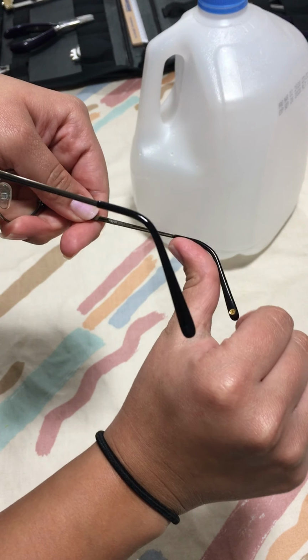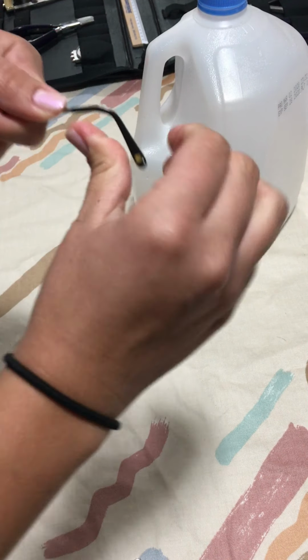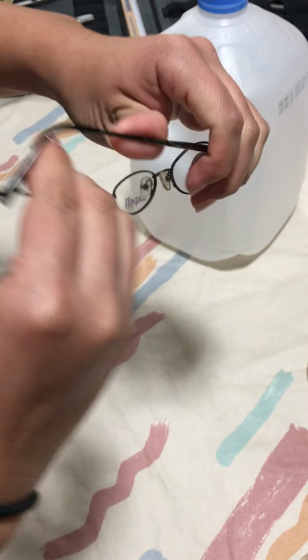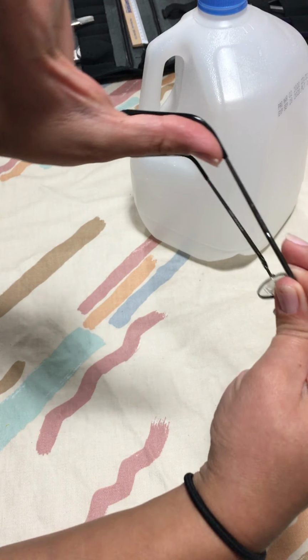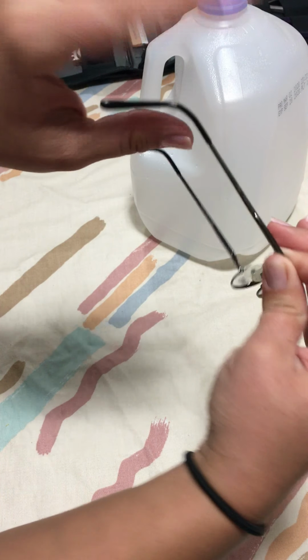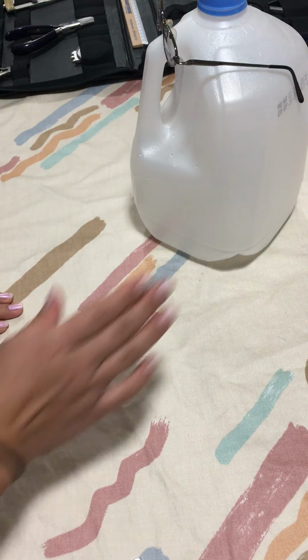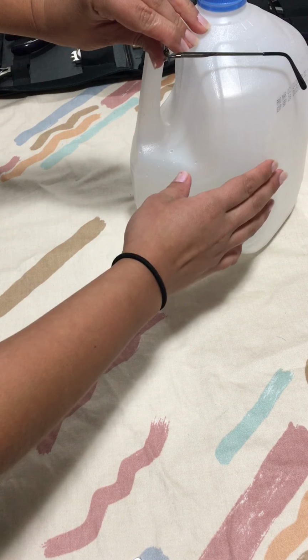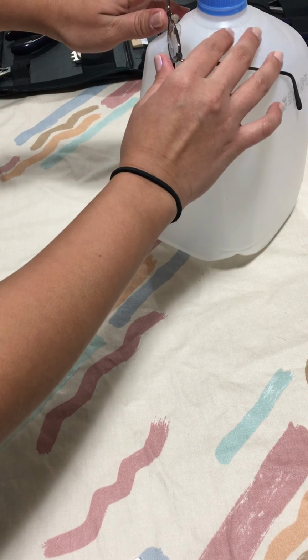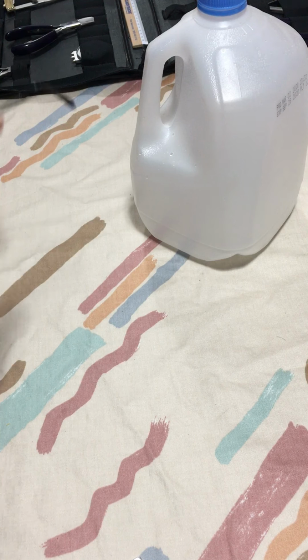Okay, I'm gonna double check. No, oh yeah, it's still a little bit. So now I'm gonna check again to see that there is no more space. Okay, so there is no space. I try it on the patient, and now it sits way better. It's not sitting like this anymore, the way it was at first. Now it's sitting down on the patient's ears. Okay, and that was the temple band misalignment.